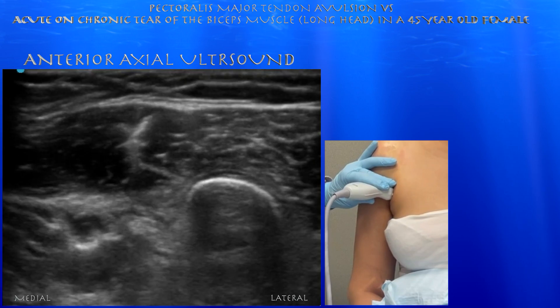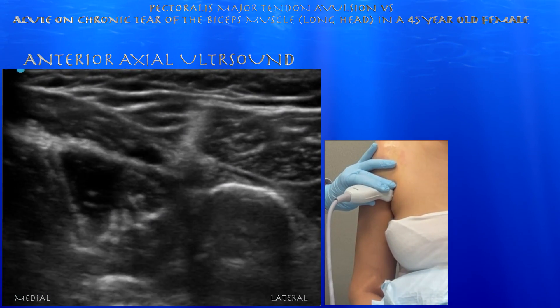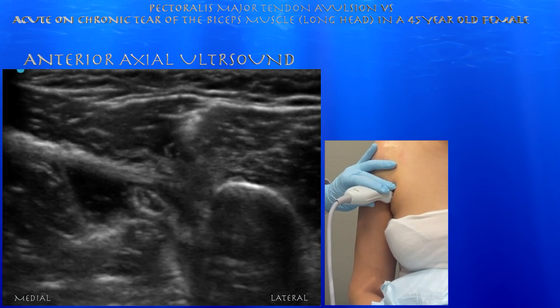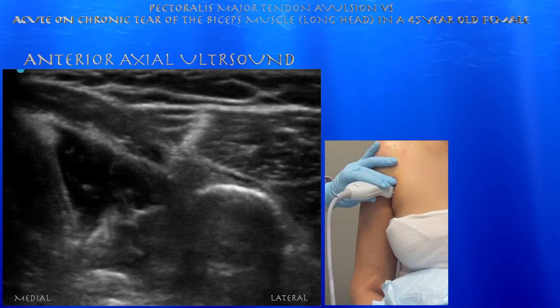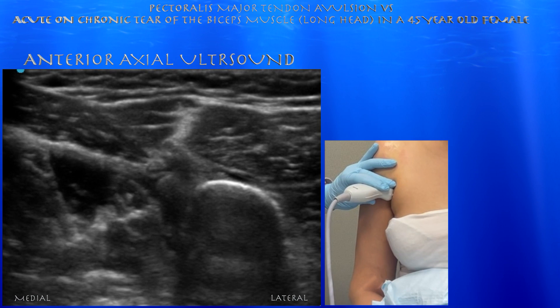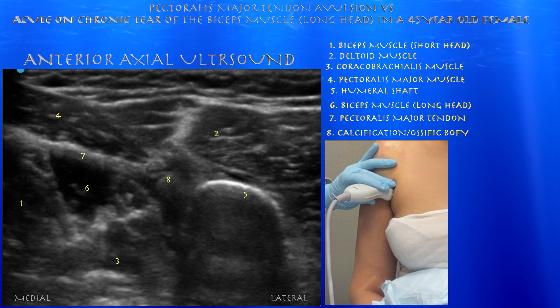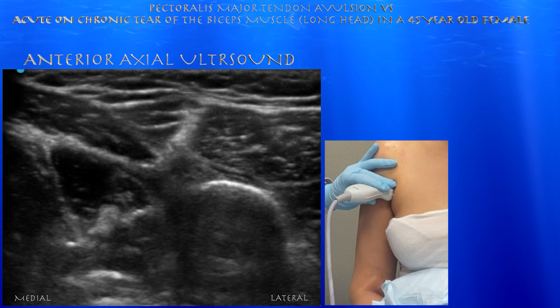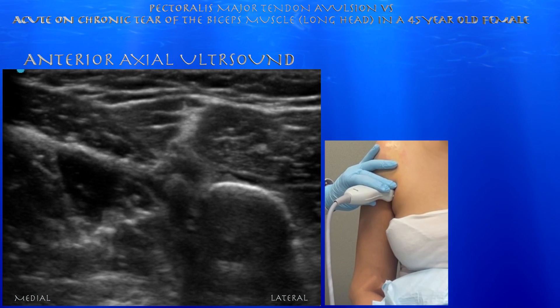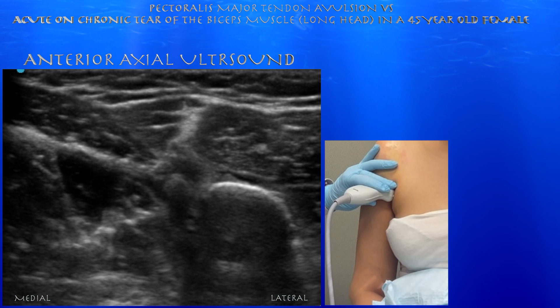Now we're going to the region of the tendons, and you can appreciate this calcific body just near the humeral shaft. It looks like it's right in line with the pect major tendon, so this could be an avulsion from the pect major tendon, or perhaps an acute and chronic strain of the biceps muscle with an old calcification in the muscle.